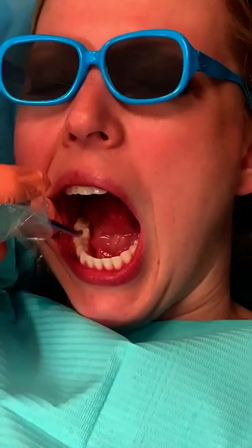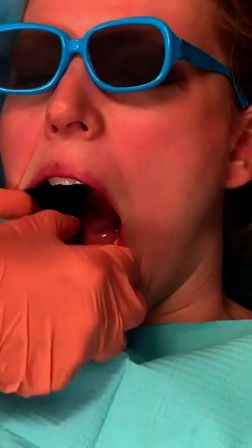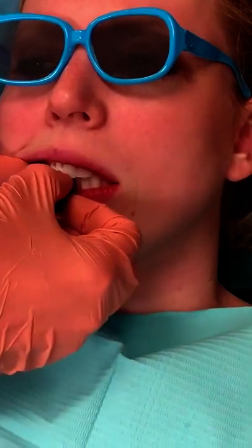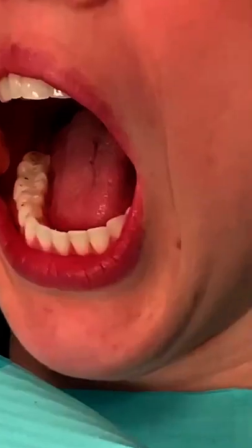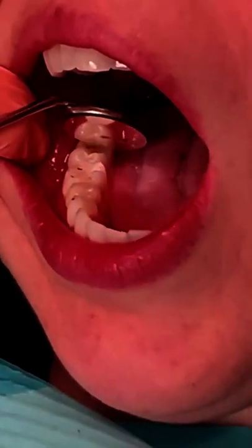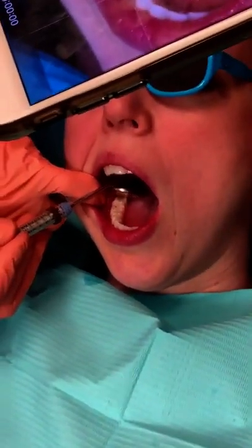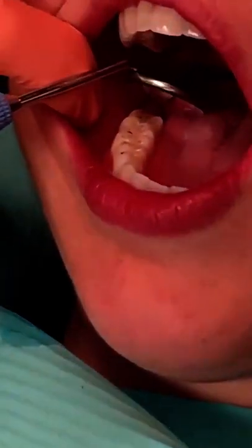And then I need to check her occlusion to make sure it's not too high. Dry off your tooth. Place the articulating paper on top — I place it on the mandible just because it's easier. Bite down, chomp, grind your teeth together, open. It is normal to have any cusp show up as blue because that's where the teeth normally occlude. You have issues if you have a spot down in the middle of the tooth or down where a pit or fissure was showing up blue — then we would have to adjust it.